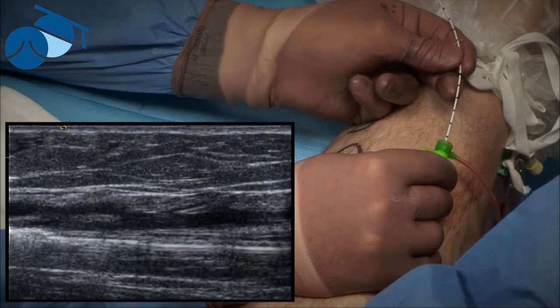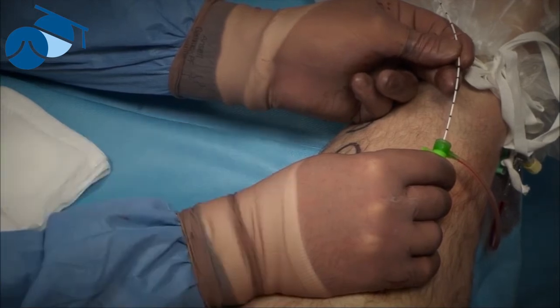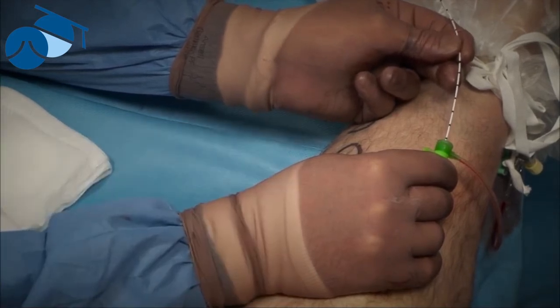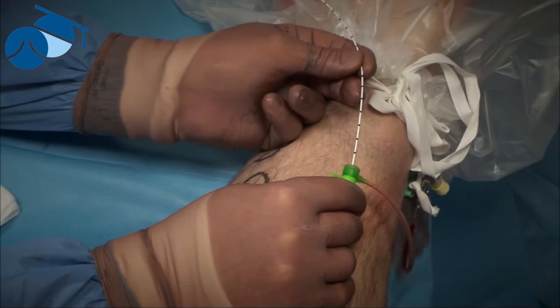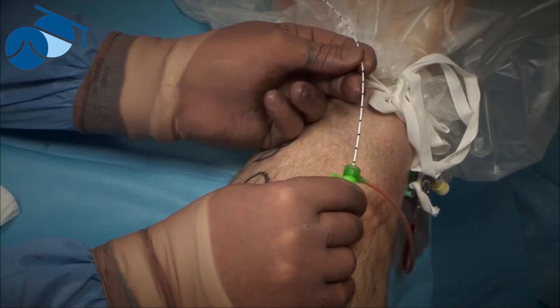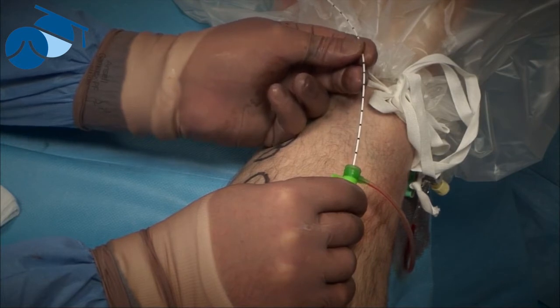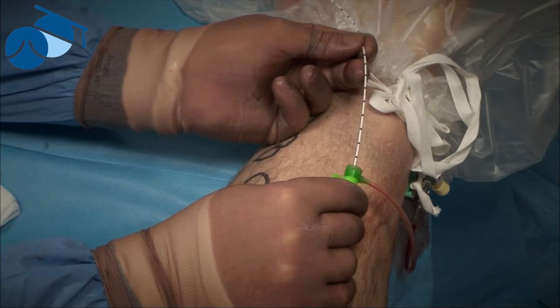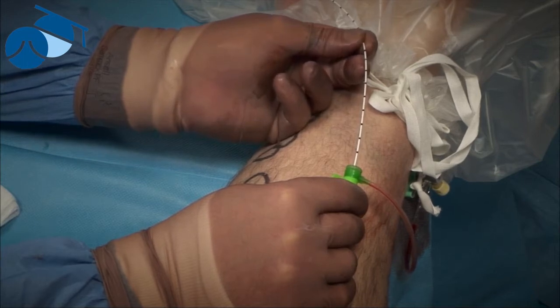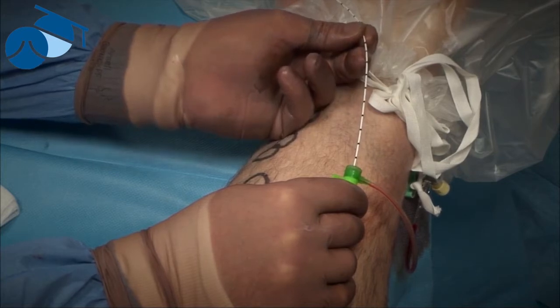Usually at this stage we can stop scanning, so Charlie's going to stop scanning there. As long as we know that the laser was up the correct vein and we've already checked that, and we know that the tumescence is fine, there's no reason to scan all the way down as we're doing this. With this system, which is very nice, we've actually got a very large black area for 2 centimetres, and when that appears we know that we are almost at the end. It's essential that you always know which cannula you're using, which introducers and which laser, so that you always get exactly the right length each time.